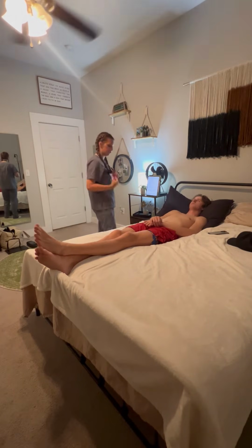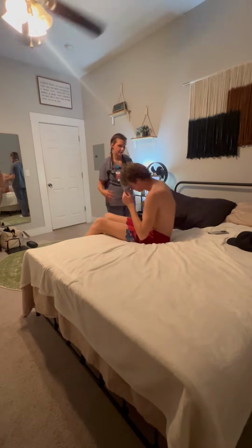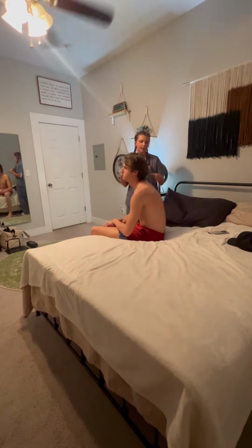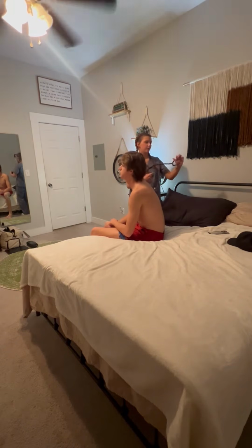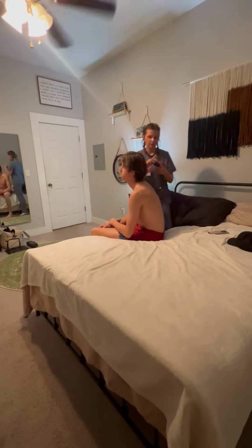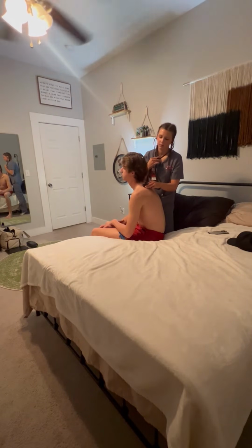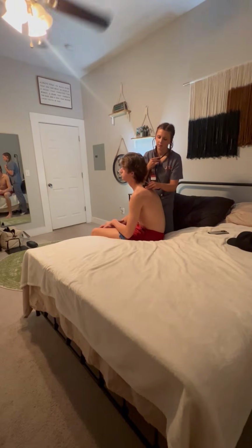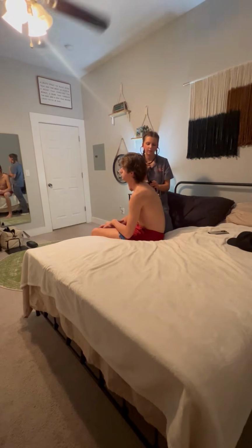So if you could just sit up for me and swing your legs across to this side, I'm gonna do the same thing on your back. So we can't hear over any bone, so we're gonna make sure to avoid that. I'm gonna start kind of up here. Just take those same good breaths for me. And do the same thing, just work my way across and down. Make sure everything sounds equal.